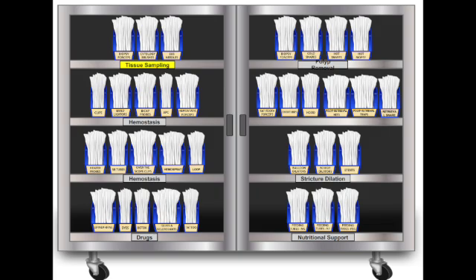And the other method? Bougie dilators. These are more rigid, tapered dilators of increasing sizes. You pass them typically over a guide wire down the esophagus. Primarily esophagus? Typically, yes. Mostly used for straightforward esophageal strictures. Less flexible than balloons for navigating angulated areas.